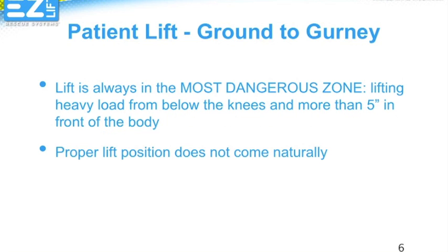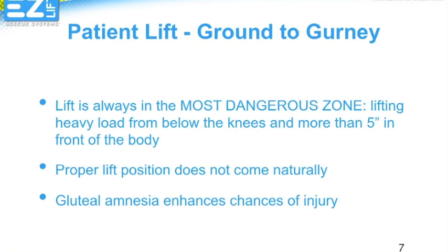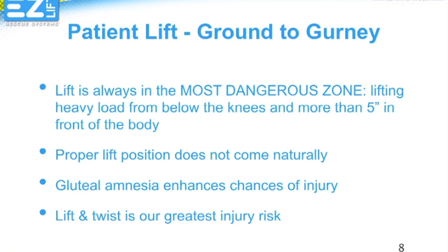In this squat position, proper lifting does not come naturally. We all know that no matter how well trained we are, at 2 o'clock in the morning we forget to lift properly, a phenomenon called gluteal amnesia. And when we lift and twist to put that heavy patient onto a gurney, we're doing one of the most dangerous things for our back: lifting and twisting.